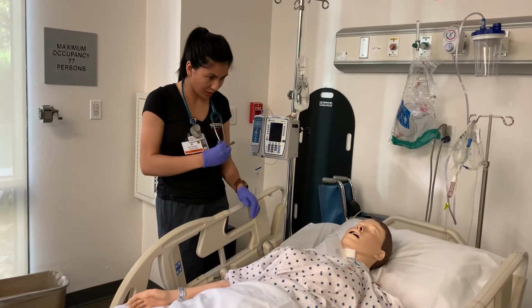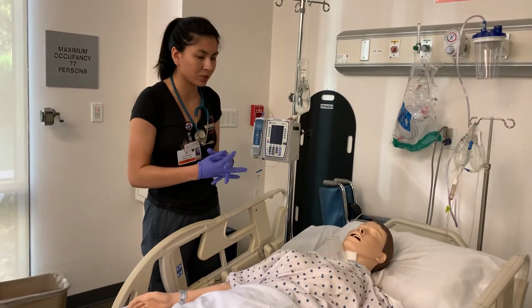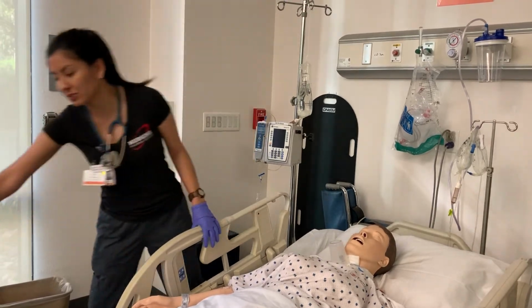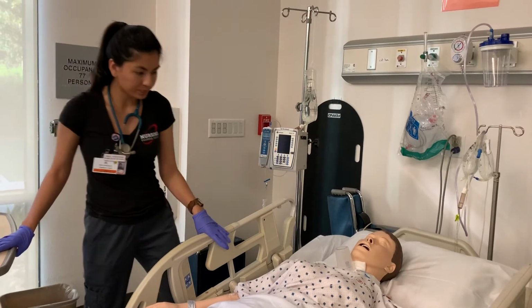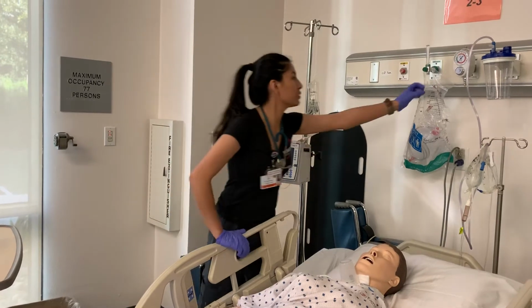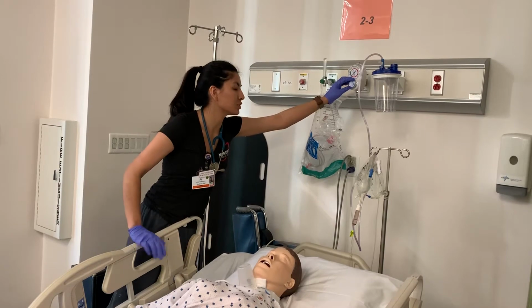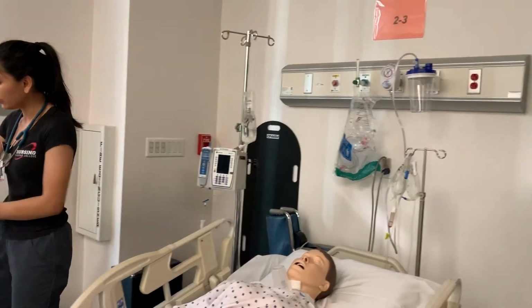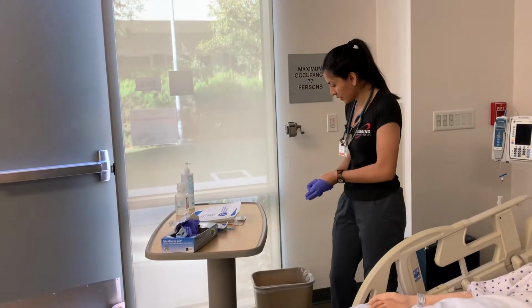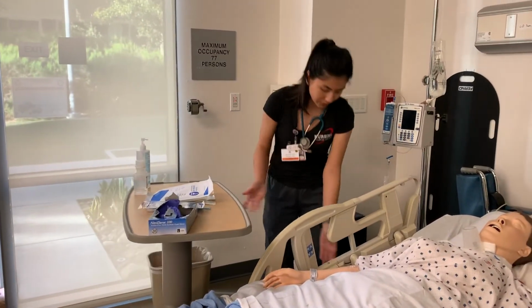So she's gone on O2, so I'm going to make sure I monitor that. And if it dips below her baseline or whatever's in that hospital policy, I'm going to go ahead and stop. Before I get my supplies ready, I'm going to make sure that my table's clean. I'm going to wipe it down. I'm going to loosen the aerosol trach collar. I'm also going to put the pressure of the suction onto 110 because it's supposed to be from 100 to 120. And I'm also going to loosen the cap on my saline water. So once that's all done, oh, and I'm also going to lower the railing.